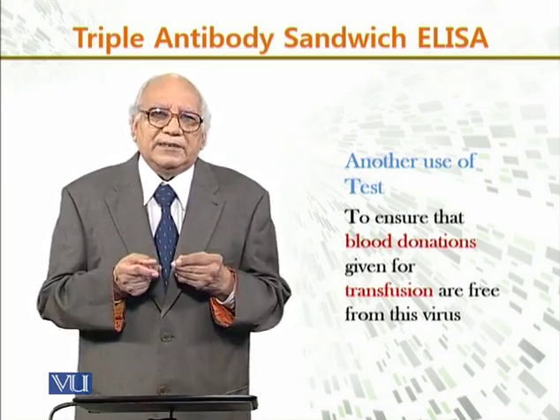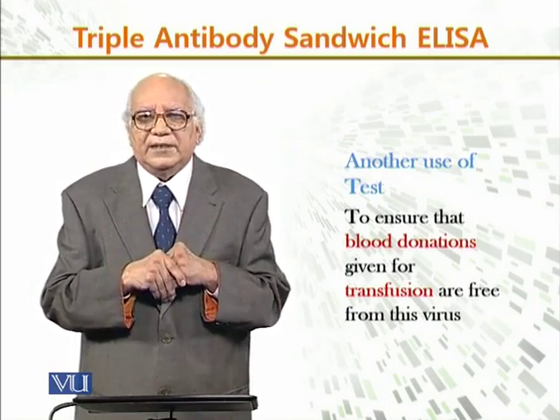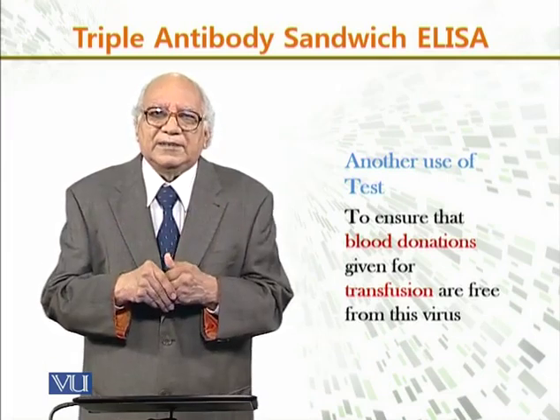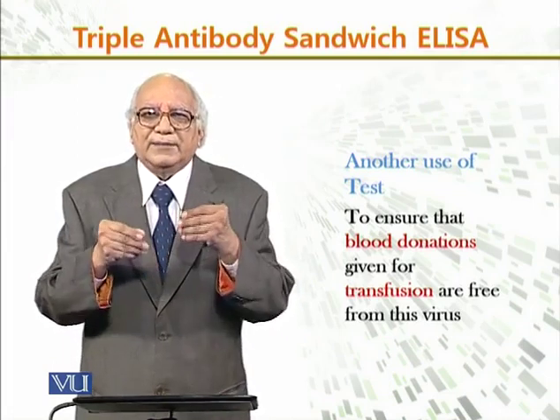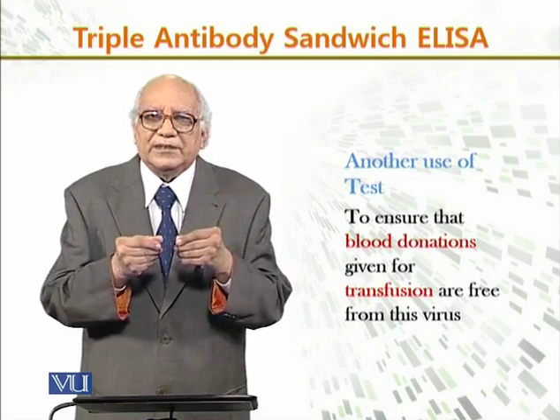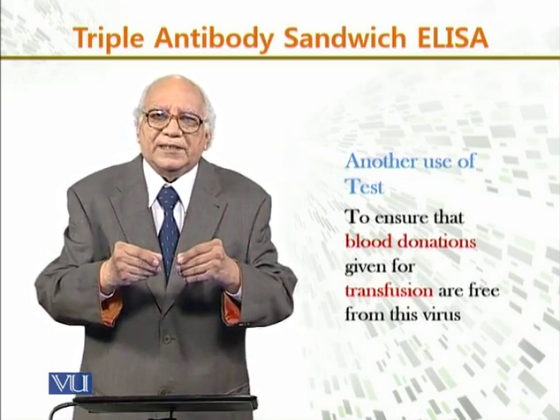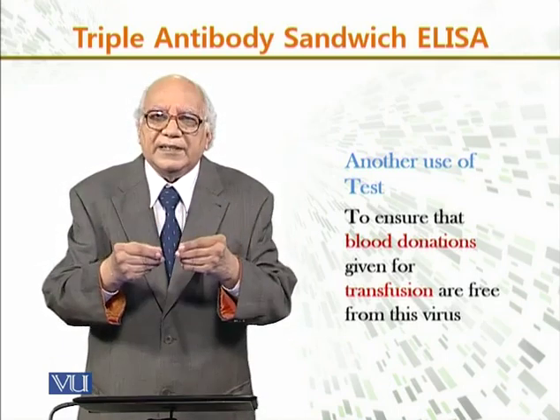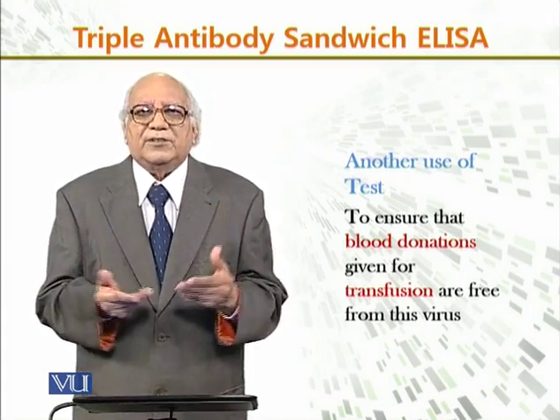For that blood, the same procedure is carried out. As we have described earlier, the blood serum is taken, centrifuged, incubated, and can be used for the test. The HBV proteins are added to the microtitre plates of ELISA. Further, the marker enzymes are added, along with the patient's blood serum.